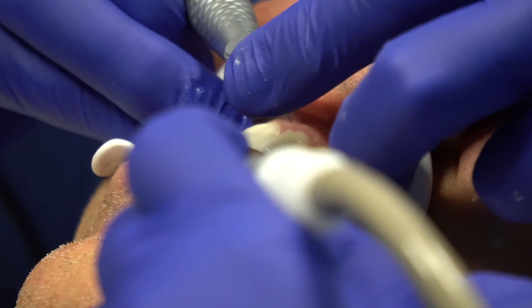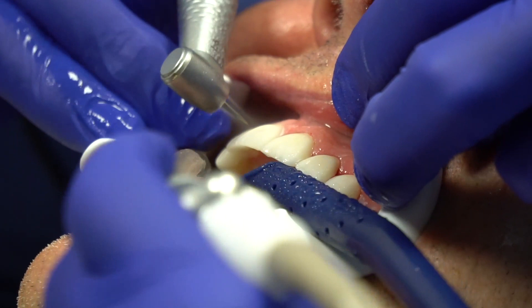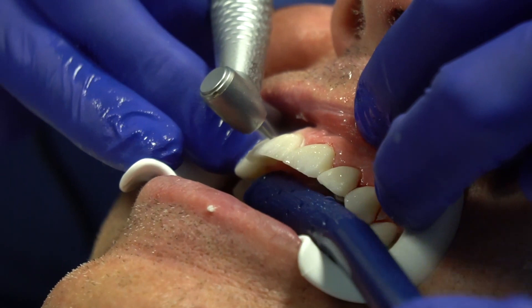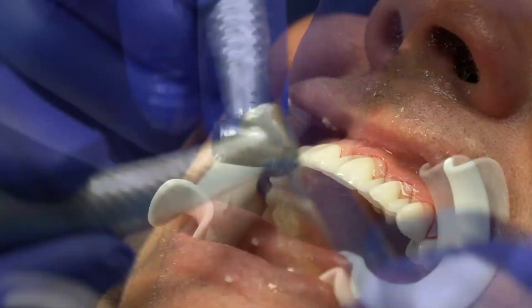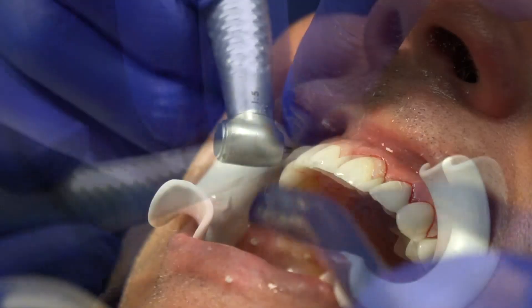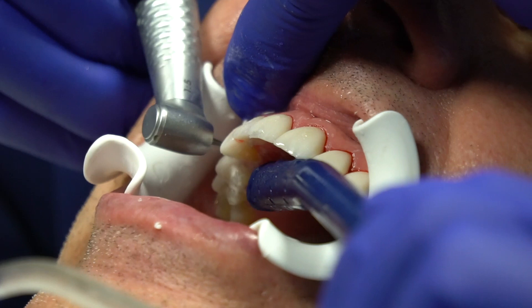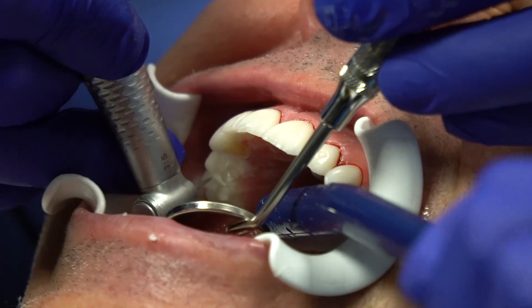Sometimes I'm using two hands, sometimes not — resting on the porcelain. I'm just going to go pretend these are a bunch of Class V restorations and clean off the excess here. The margins are there — you just need to finish them. If you clean up a little more it's easier, but if you clean up too much and pull it out from a margin, that's not good. Then I'm going to go on the lingual side, up in the embrasures. There's a bunch of little excess composite on the lingual surface.